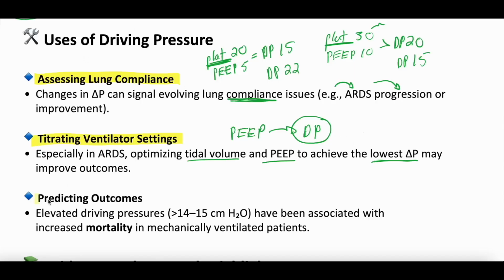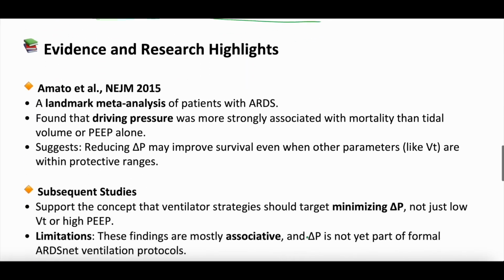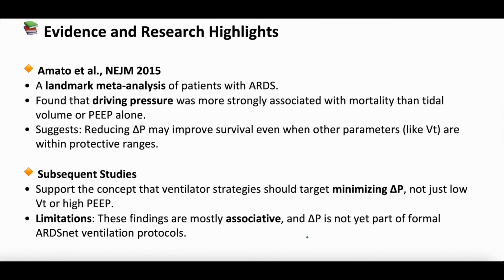And then predicting outcomes, we don't use this as much, at least personally, but elevated driving pressures are associated with increased mortality in mechanically ventilated patients. So if you were to think a little bit about the evidence, this is just as of this video recording, there's certainly other evidence out there. But in 2015, in the New England Journal of Medicine, there was a landmark meta-analysis of patients with ARDS, and this is when driving pressure kind of came more so into the forefront. And it found that driving pressure was more strongly associated with mortality than even tidal volumes or PEEP. So it suggests that reducing the driving pressure may improve survival in these patients with ARDS.